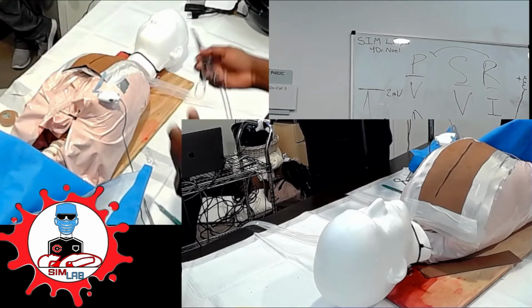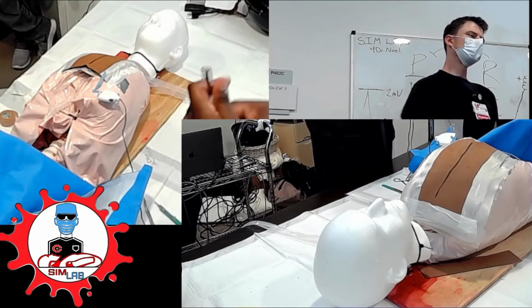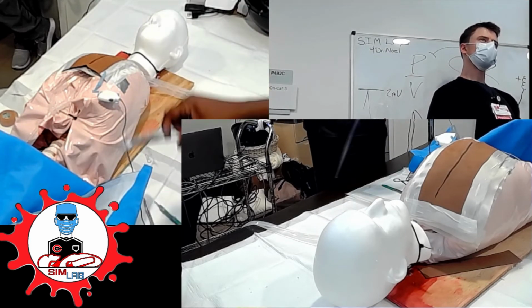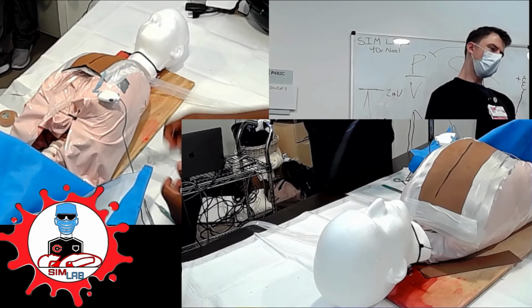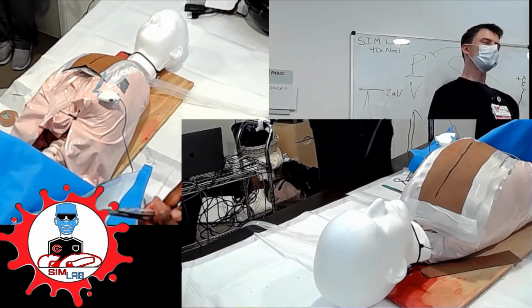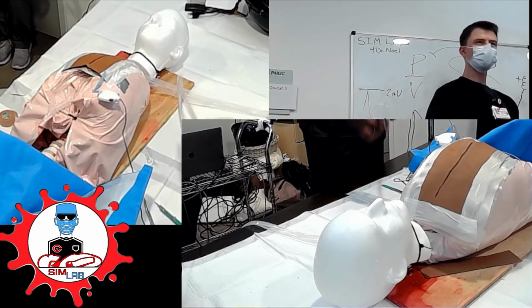If you're draining blood, I'll usually try to aim it more inferior and posterior, where it's going to accumulate, and then suture it in, and then hook it up to drainage. Awesome. All right, put it in.